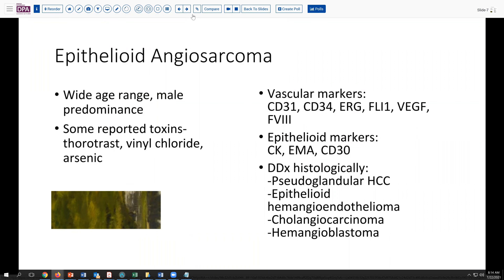Epithelioid angiosarcoma is a lesion which is rather uncommon in the liver. It does occur over a wide age range and is more frequently seen in males. Although many earlier reports noted associations with toxins like Thorotrast, vinyl chloride, and arsenic, these are relatively uncommonly detected in current cases. This tumor may occasionally also express epithelial markers such as cytokeratin; in our particular case, it expressed EMA. One can see how pseudoglandular hepatocellular carcinoma, cholangiocarcinoma, and hemangioblastomas could also enter into the differential considerations.